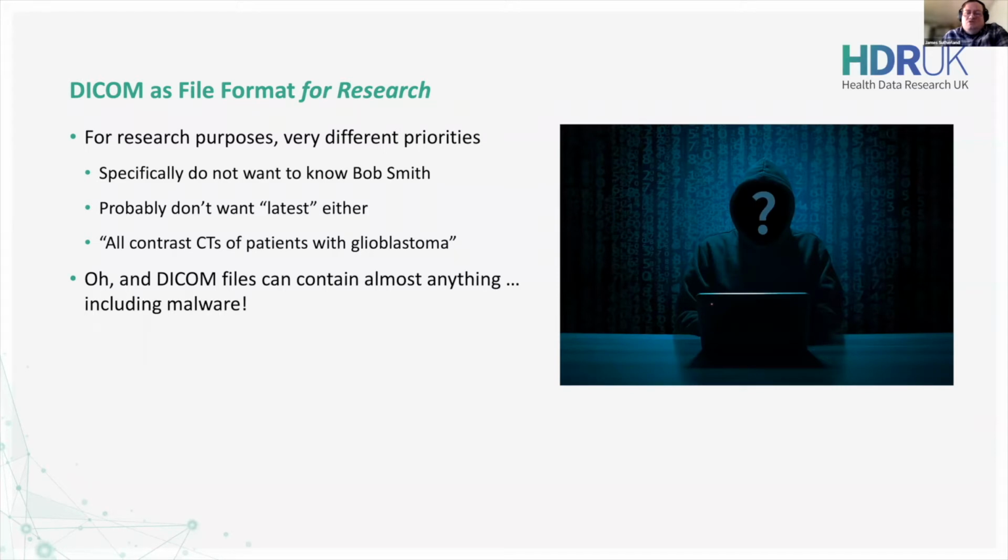So we can use that to generate a list of the patients who do have this particular condition, and then match that by patient ID, and then filter out just the CT scans, and then we can filter within that for just the images that used either contrast in general or a particular contrast agent that's relevant to your study.